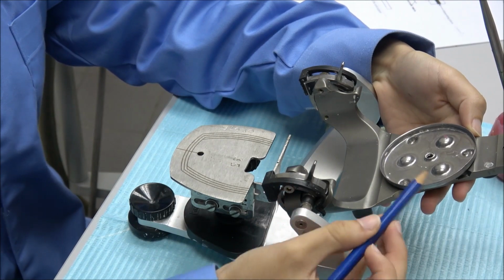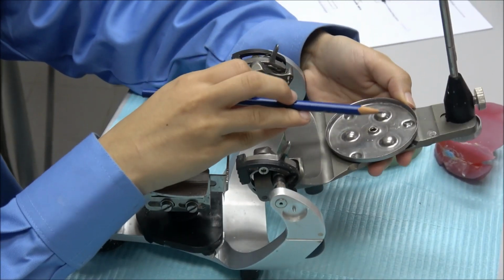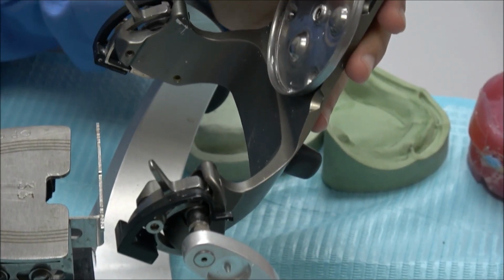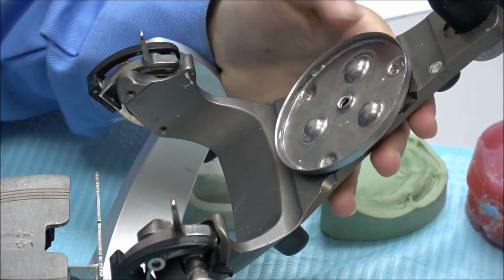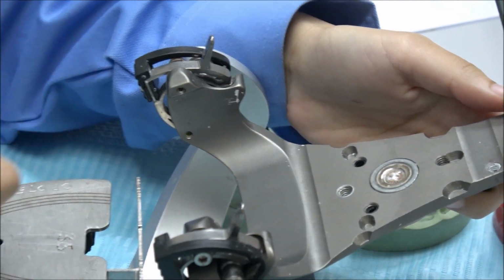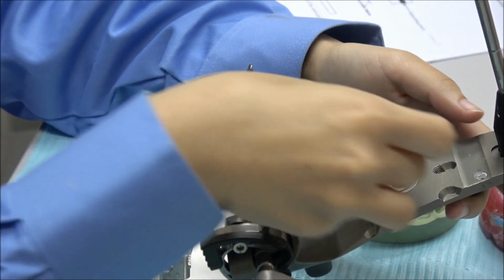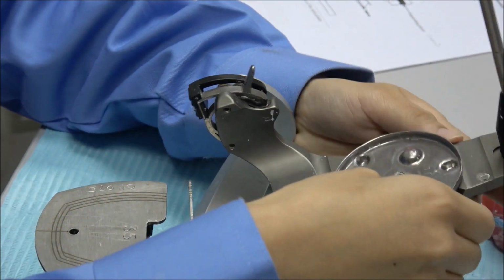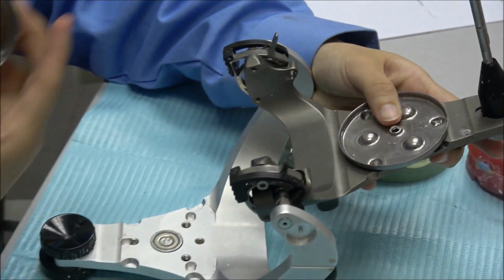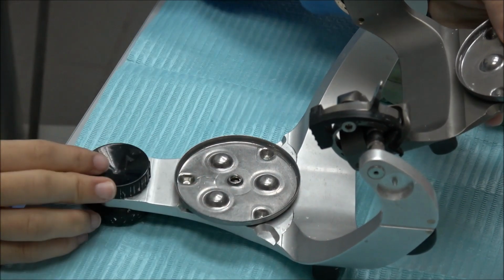Okay, this is our mounting plate. Can you see there is an arrow here? Make sure the arrow is facing to our incisor rod. Every time, make a note here. Every time, make sure the arrow is facing up, because a lot of your seniors made the mistake here. And then make sure it's locked properly. For the lower, it's the same. Make sure the arrow is facing up and lock it. Okay.